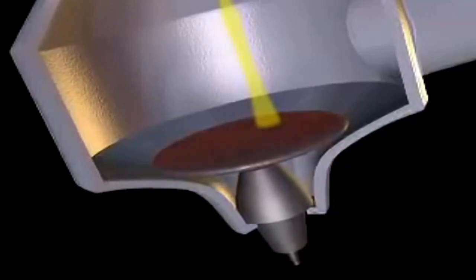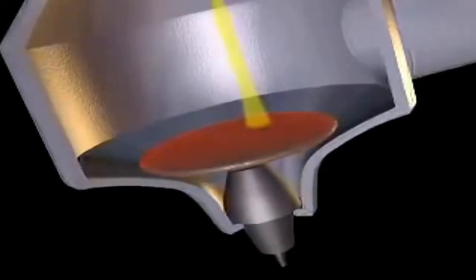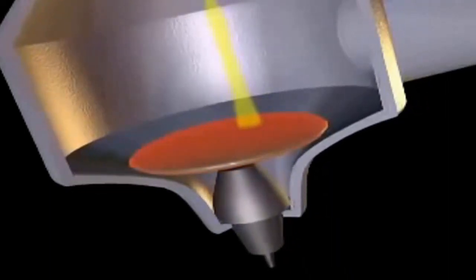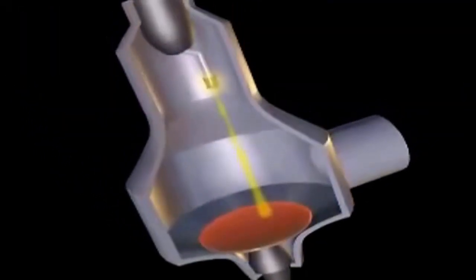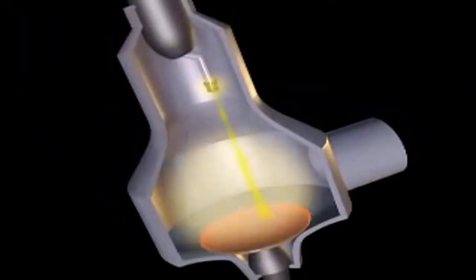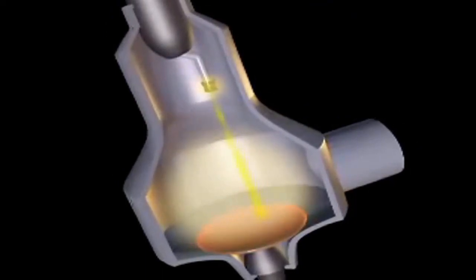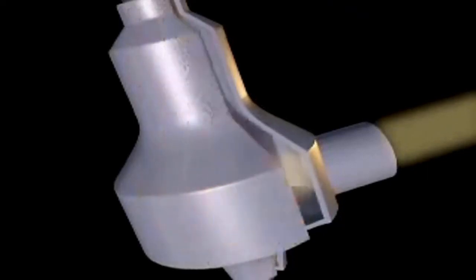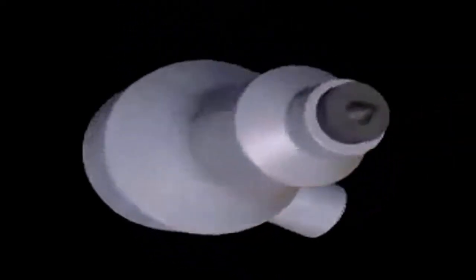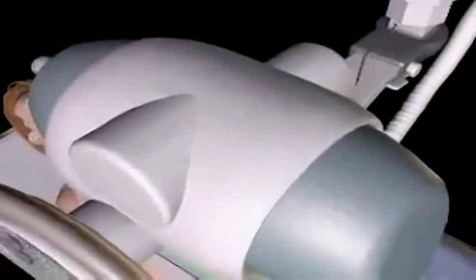The anode, located on the opposite end of the X-ray tube, is a disc made of tungsten, a material that attracts the electrons. When the electrons released from the cathode come in contact with the tungsten, they release energy in the form of photons. These highly energized photons are channeled through a lead cylinder and a series of filters, creating an X-ray beam.